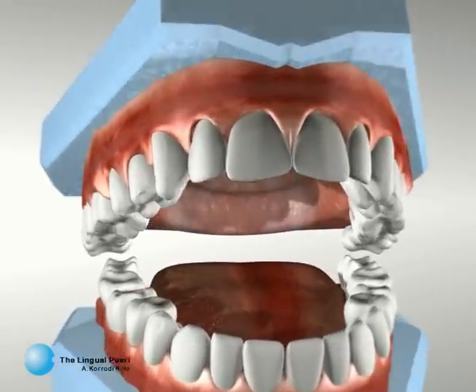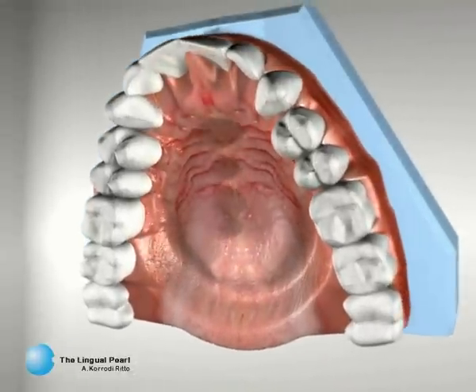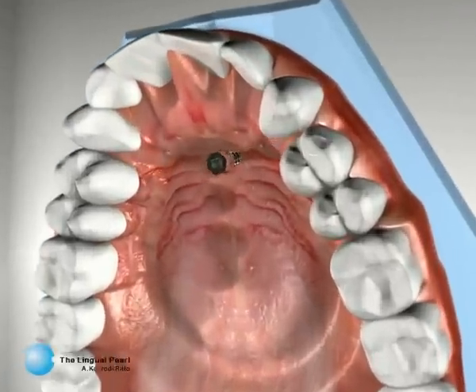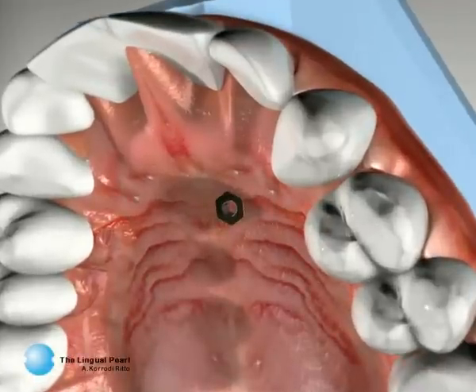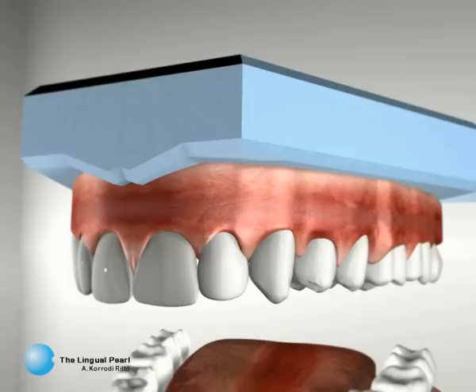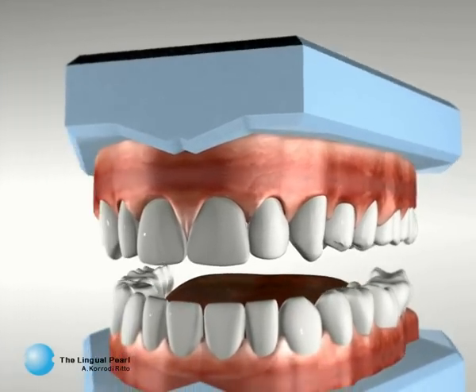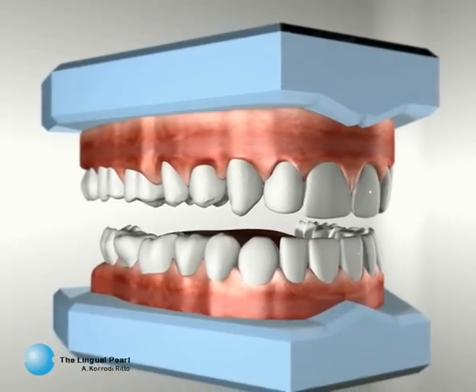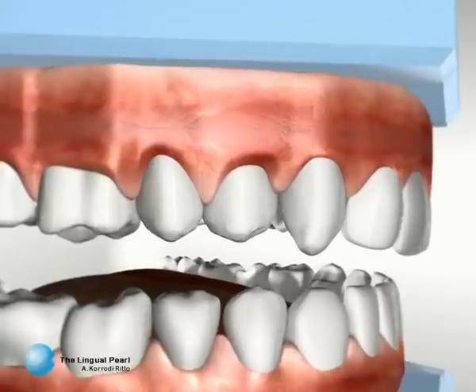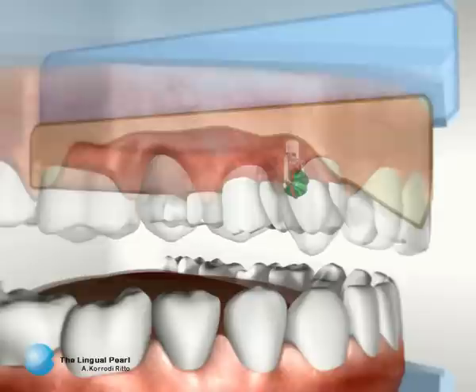The Lingual Pearl is a passive appliance to help in the re-education of the position of the tongue, re-education of the swallow and the speech. It can be used in a transpalatal bar, bonded to premolars or deciduous teeth, in retainers, or applied to micro-implants, depending on what we want and depending on the stage of the orthodontic treatment. The Mia Pearl Total Concept.